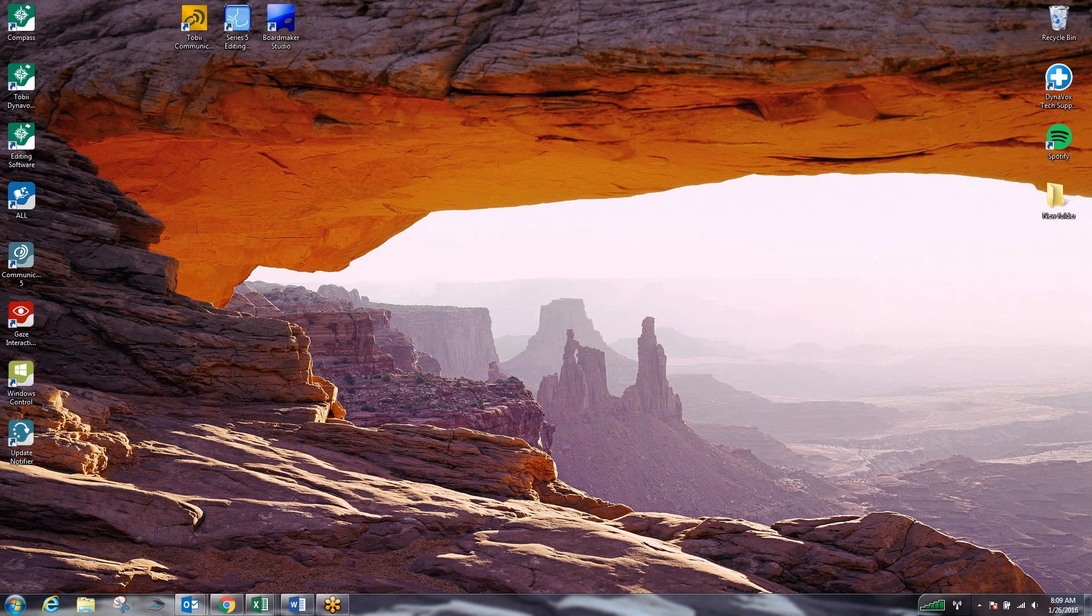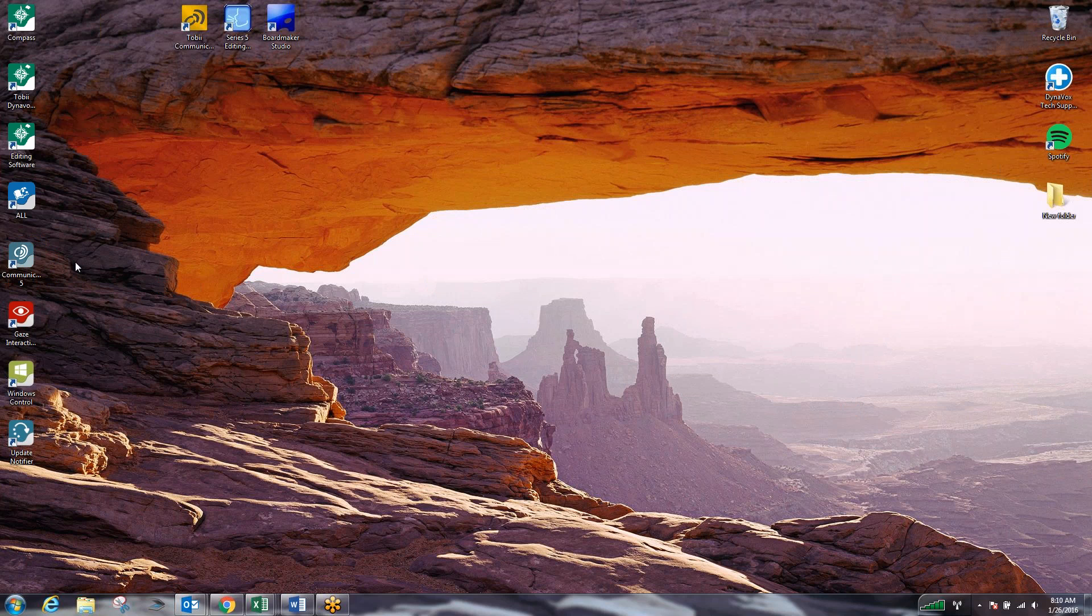So once you start up the device you'll come to your Windows desktop screen. It will look similar to this but with a green background. What you're looking for is the Communicator 5 symbol. This is the speech software we're going to be utilizing today. Set the device on a table or clip it into the mounting system and then come over and double click the Communicator 5 software and open it up.